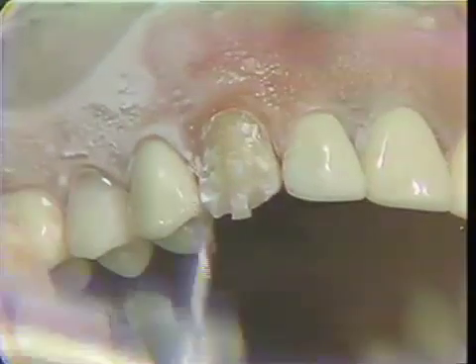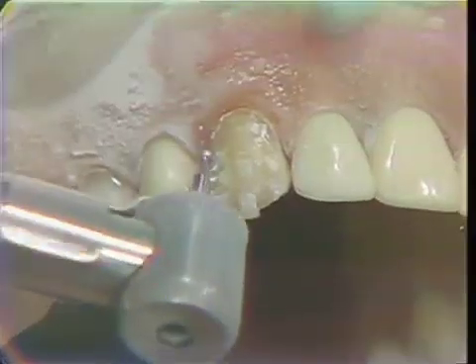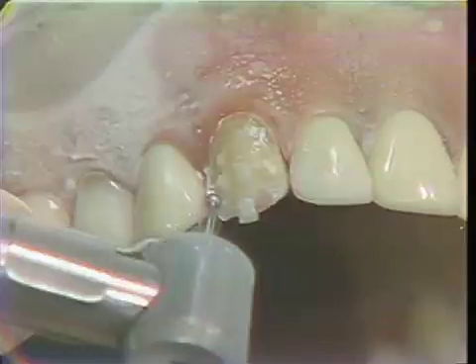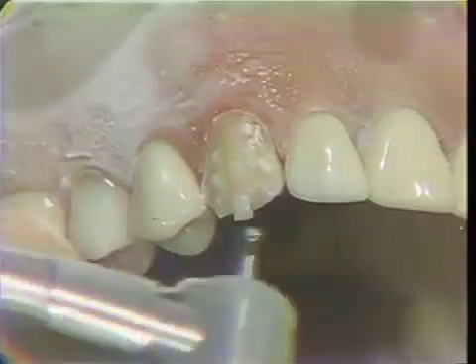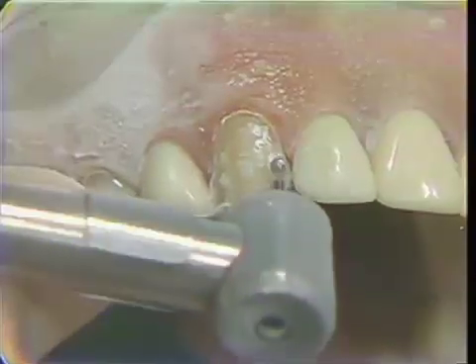Now you can also take this round burr and use it to open up the embrasure slightly, and we will do this with the same diamond, open up the embrasure on each side of the tooth.